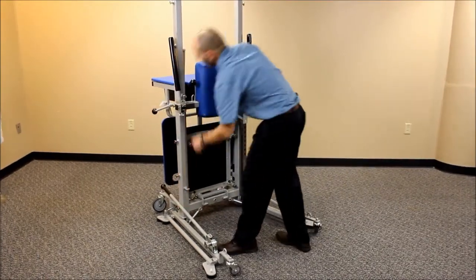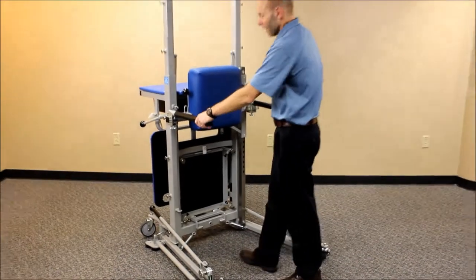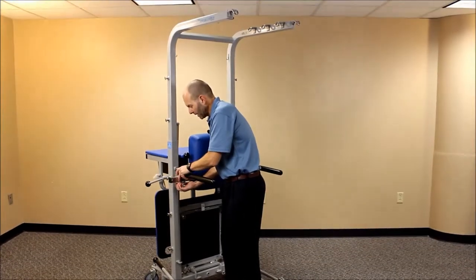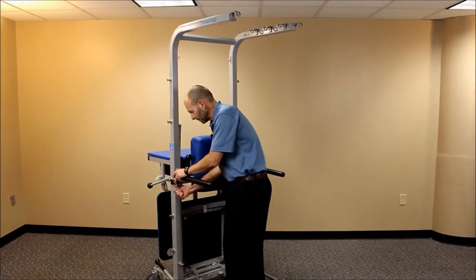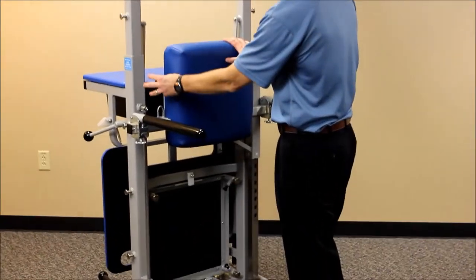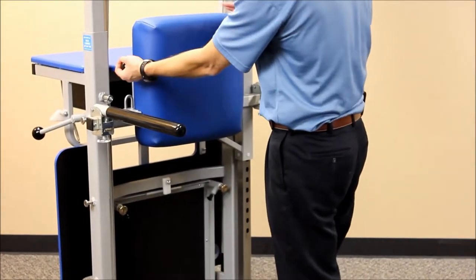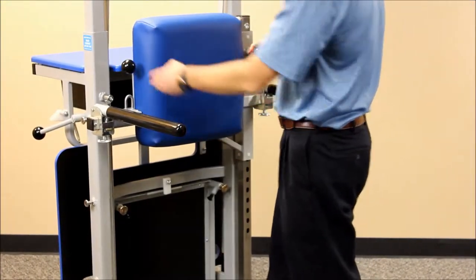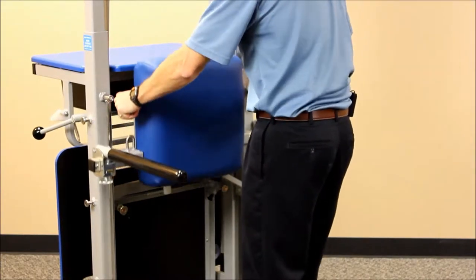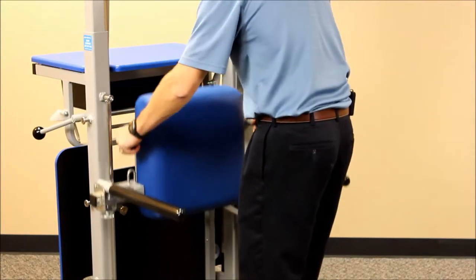Now let's talk about the support bars, which can be used by the patient for upper extremity support. These are adjustable in width, so you can move them in and out. You can also adjust the height by grabbing the ball on each side — one side has a pull lever, the other is essentially a handle. Pull out and you can lower or raise this to the appropriate height for your patient.